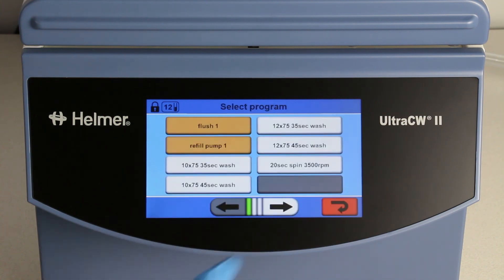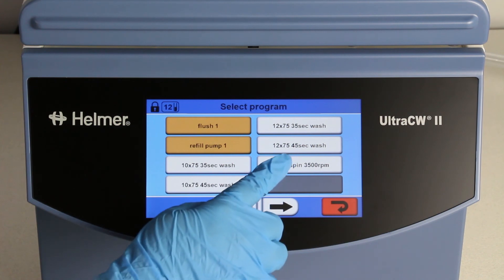Let's also take a look at the spin program. The time is 20 seconds and speed is 3500 RPM.